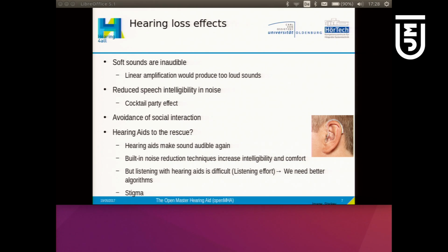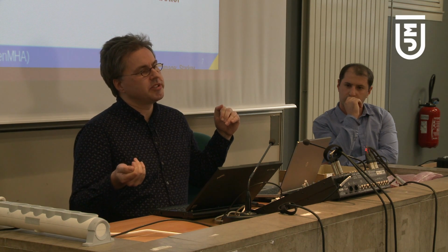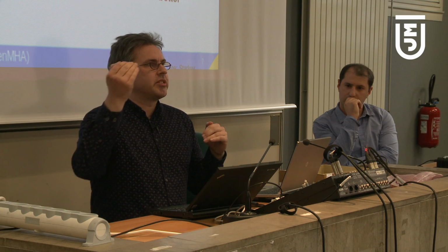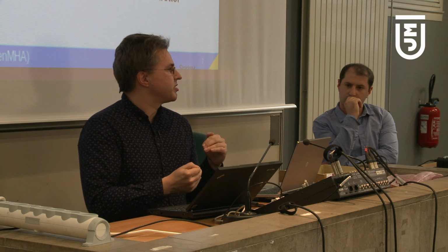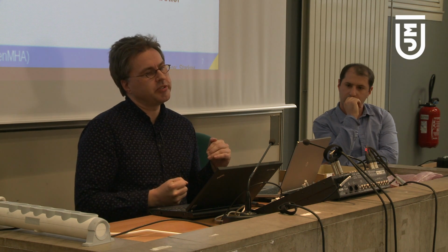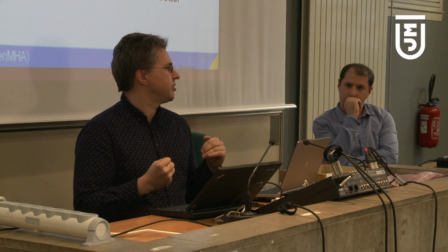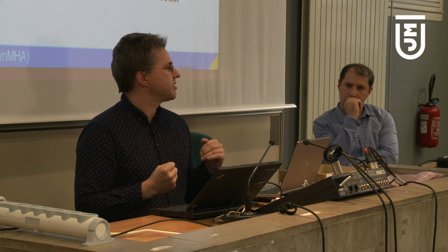But hearing aids make sound audible again. They usually have built-in noise reduction techniques that increase intelligibility and listening comfort. But listening with hearing aids is still difficult because hearing aids restore the audibility, but the reduced information channel that I told you earlier forces hard of hearing people with a hearing aid to spend mental effort on actually understanding what is being said.